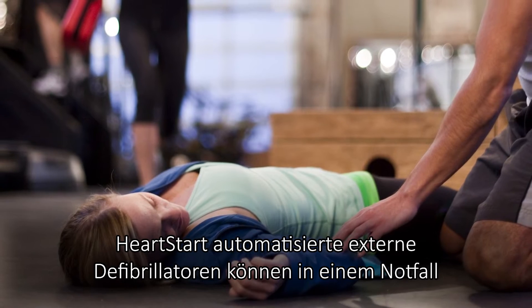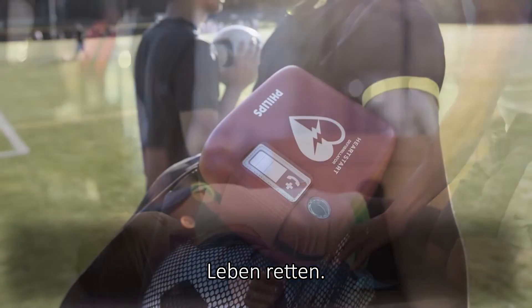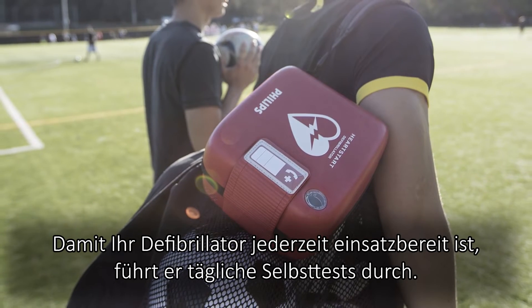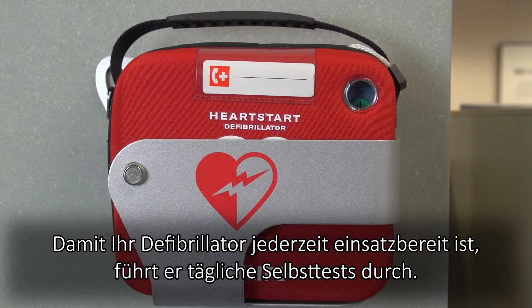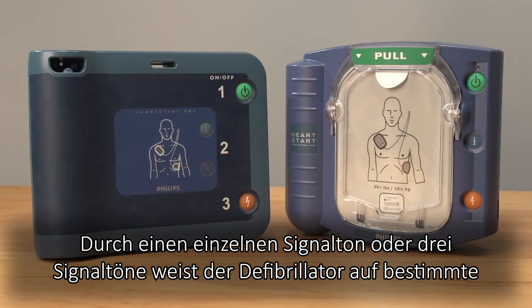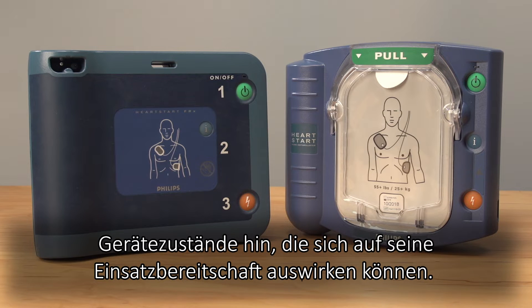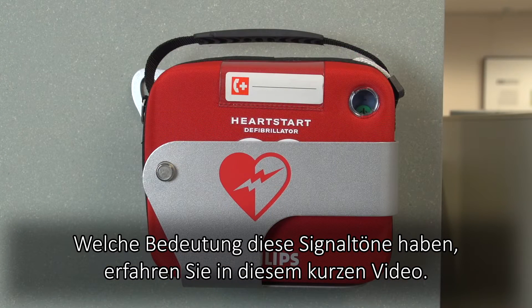HeartStart automated external defibrillators deliver life-saving therapy in an emergency. To ensure that your defibrillator is ready to deliver that therapy whenever an emergency occurs, it performs daily self-tests. It produces a single chirp or triple chirps to alert you about certain device conditions that may impact its readiness in an emergency. In this short video, we explain how to interpret these audio chirps.